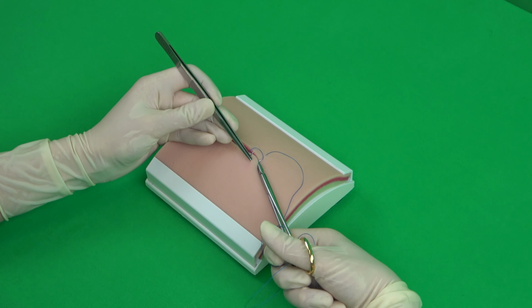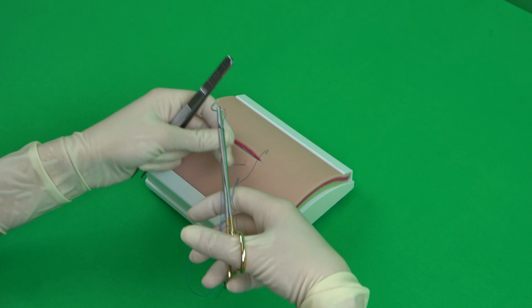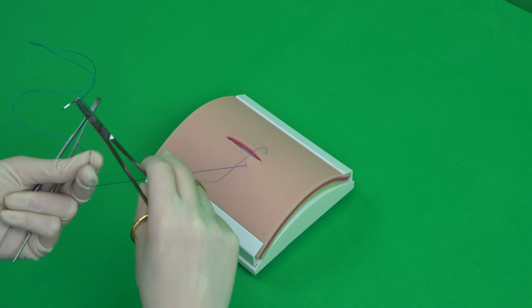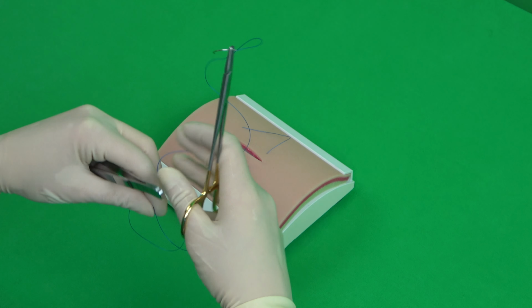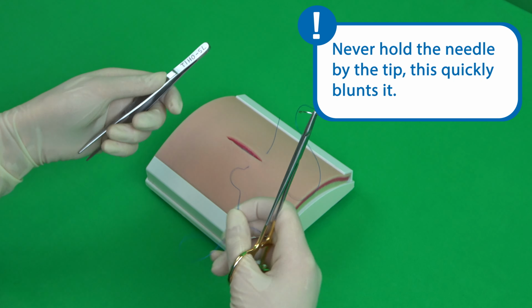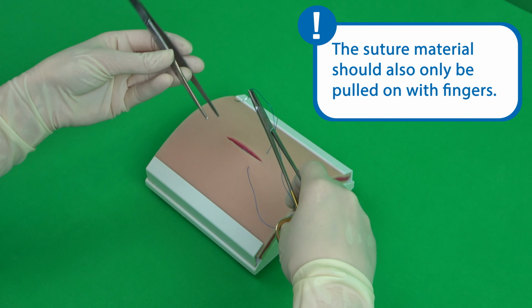The needle can then once again be grasped with the forceps, placed back into the needle holder, and the suture material is pulled through. The needle should be placed in the same position as will be required for the next step. It is vital that the needle tip is never held, as this can quickly lead to blunting. The suture material should also only be pulled on with fingers.